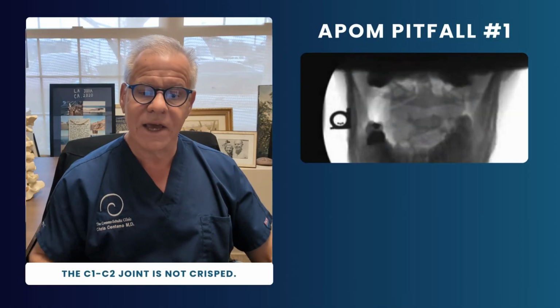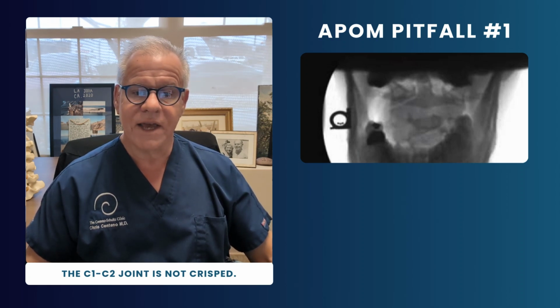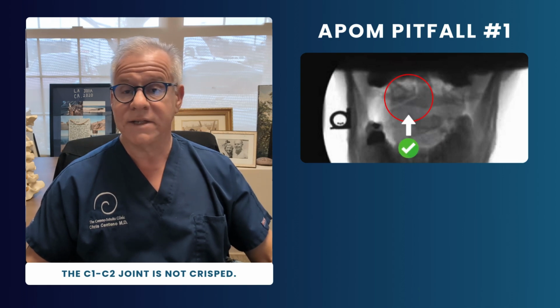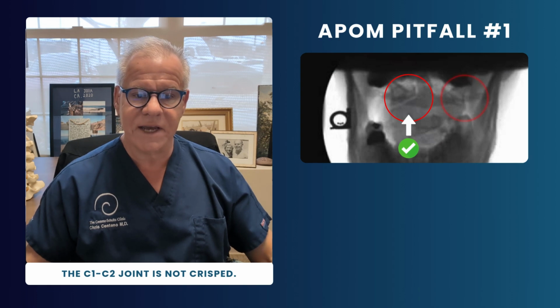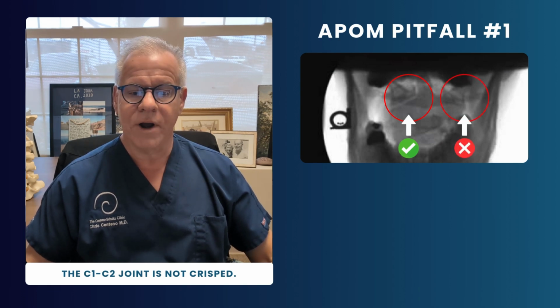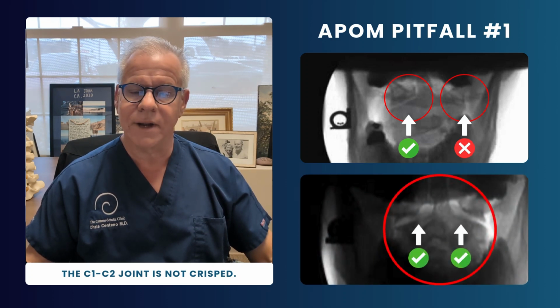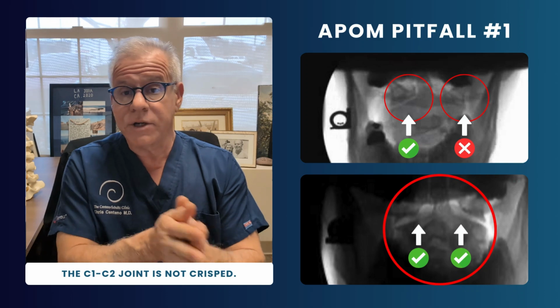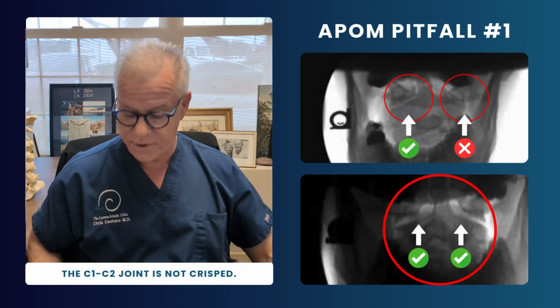As you see here, this is an area with a potential problem. You can see that this joint is nicely crisped up on this AP open mouth view, but you can't really see this joint in the same way. Whereas this one down here, both C1-C2 facet joints are crisped up. So that's what we want. We want the two check marks where you can see both of those C1-C2 facet joints very crisp.